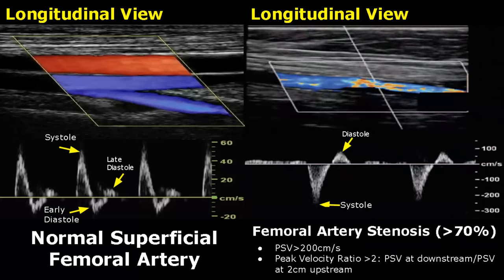Criteria for stenosis greater than 70 percent is a combination of PSV of more than 200 centimeters per second and a peak velocity ratio greater than 2. Peak velocity ratio is the ratio between PSV at the stenosis and PSV at 2 centimeters upstream from the site of stenosis. For example, in this case, if we take a downstream PSV of 200 and divide it by an upstream velocity of 60, that gives 3.3 — which is greater than 2, so the stenosis is greater than 70 percent.